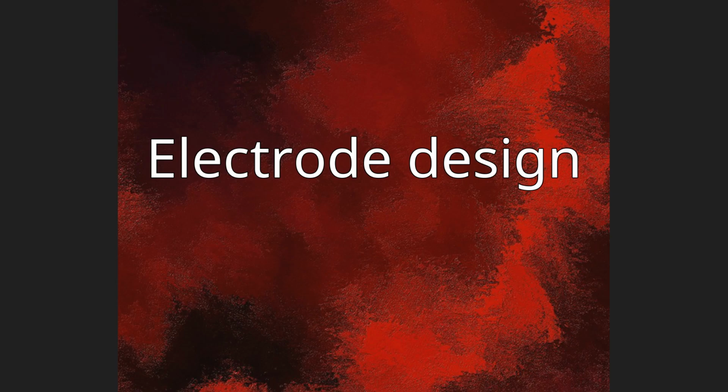Electrode design. Kennedy's research details the use of a glass cone electrode which contains a microwire built inside of it. 41. The microwire is used for recording, and the cone is filled with neurotrophic substances or neural tissue in order to promote growth of local neurons into the electrode to allow for recording. This approach overcomes tissue response by encouraging neurons to grow closer to the recording surface.